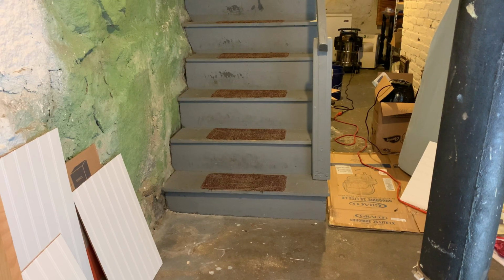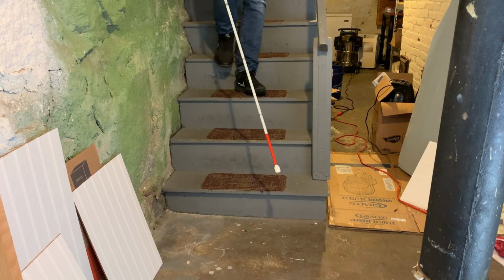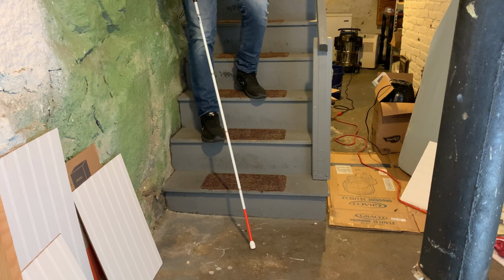So now for the final step, I'm going to keep continuing to walk down the stairs. So again, I'm continuing down the stairs. My cane tip is hovering over each next step, and then when I get to the bottom, I'm going to be able to feel either the landing or the ground with my cane. So my cane no longer is hovering because it got stopped by the floor or the landing.